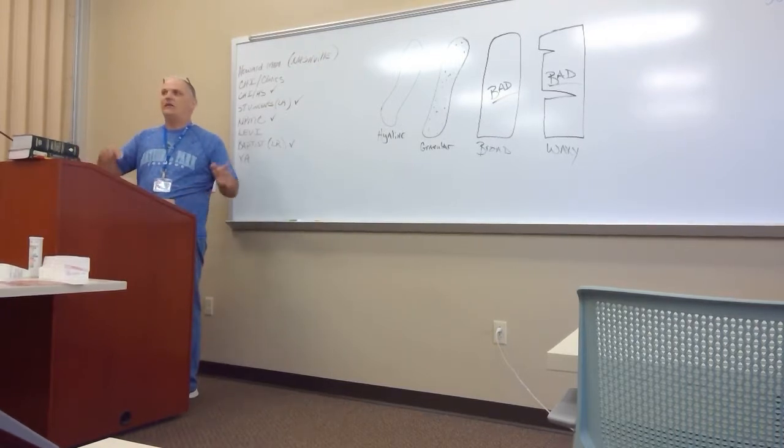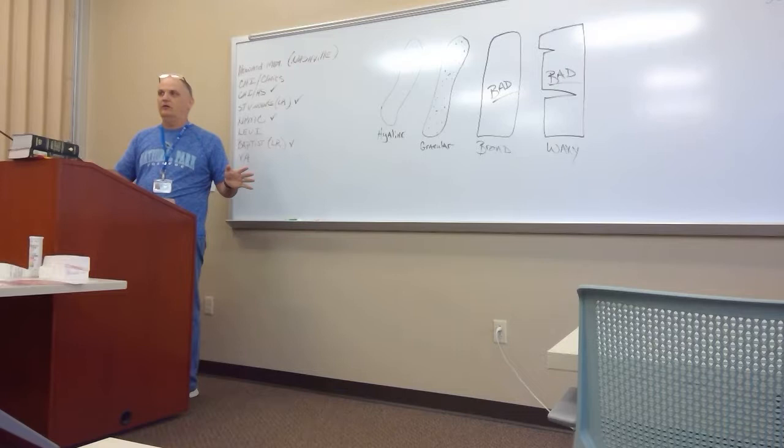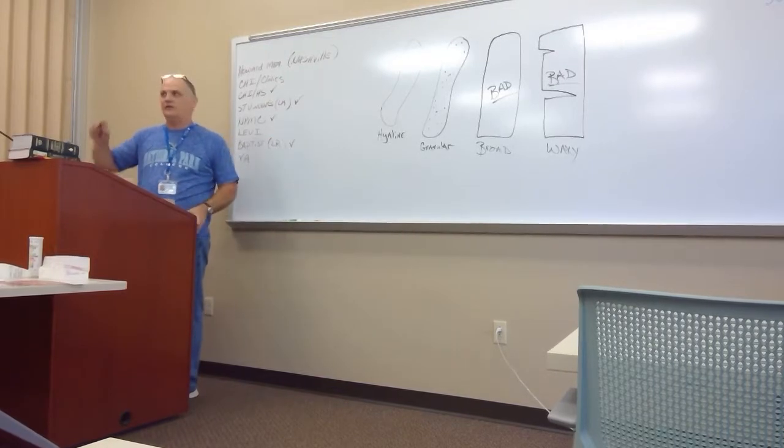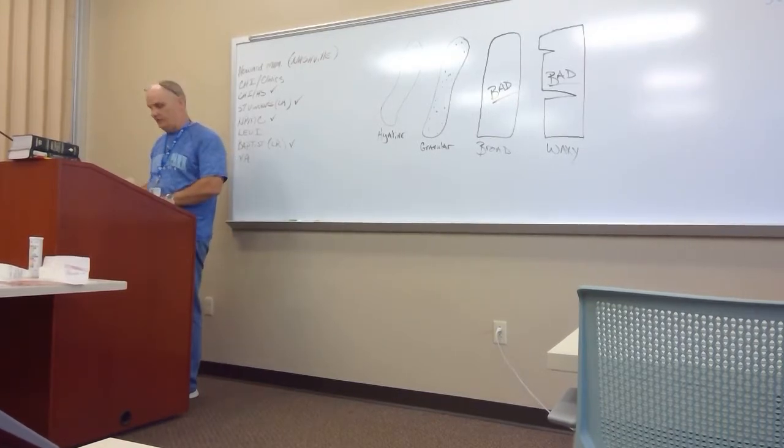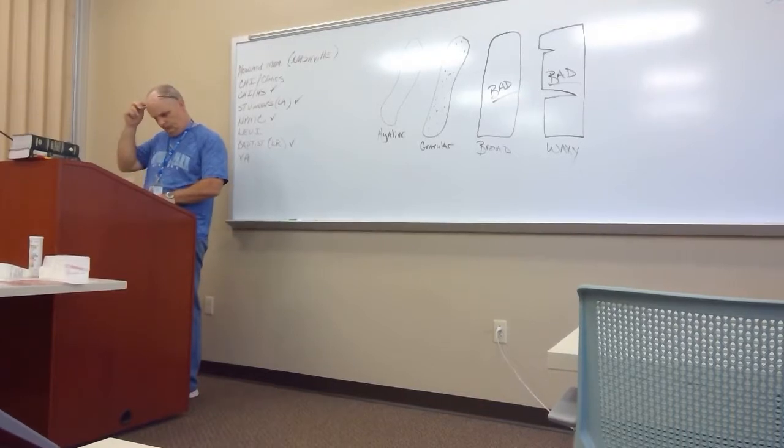So if I asked you out of the casts that I just told you about, even though I didn't list it on there, if I said this cast is capable of polarizing light, it's going to be the fatty one. Fatty cast, okay, because it has a cross.